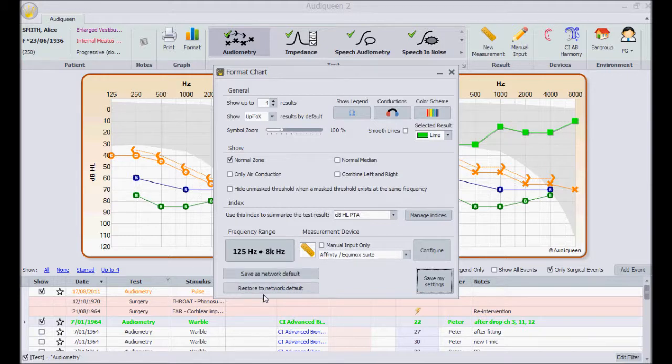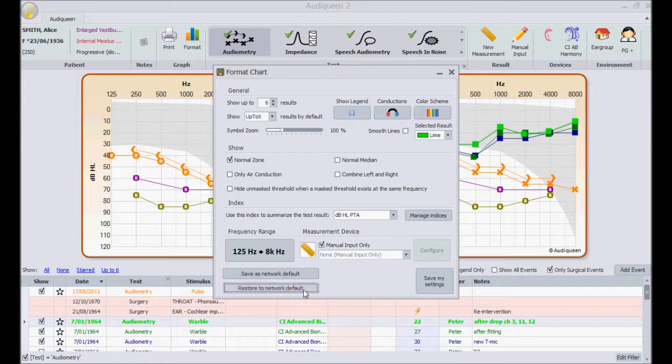If I have overruled the default settings with my own options, this is how I can restore the format settings back to the default network settings.